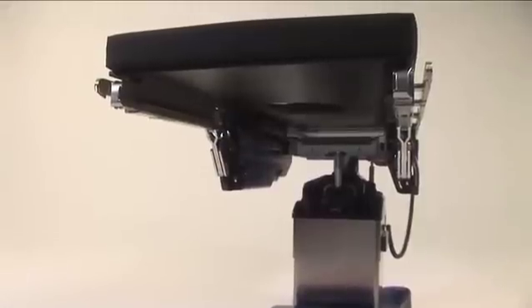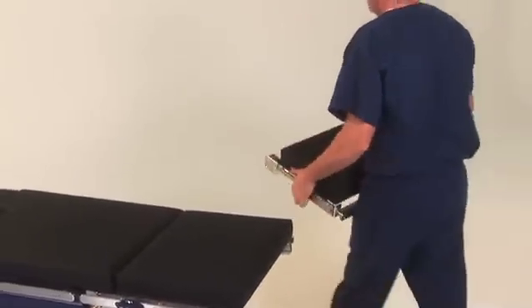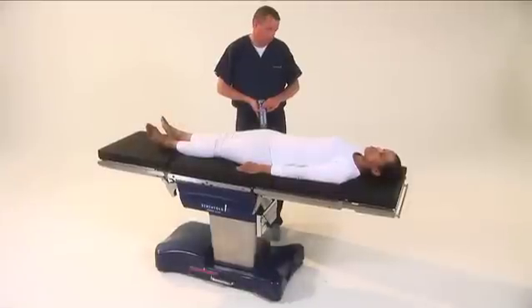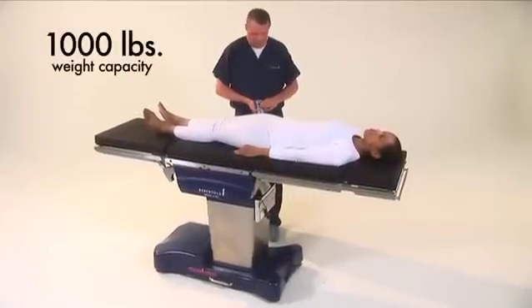For lower body imaging, slide the table towards the foot. Remove the head section and attach it to the leg section. Regardless of the slide position, the table will accommodate up to a 1,000-pound patient in normal orientation, without tipping.